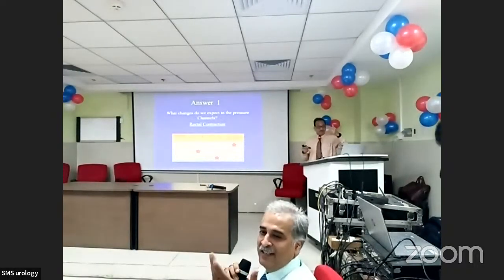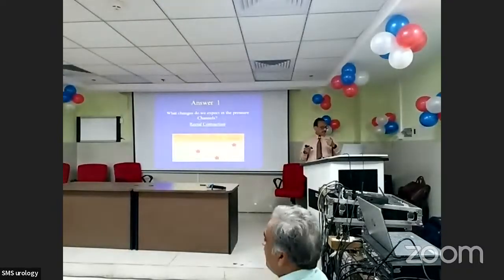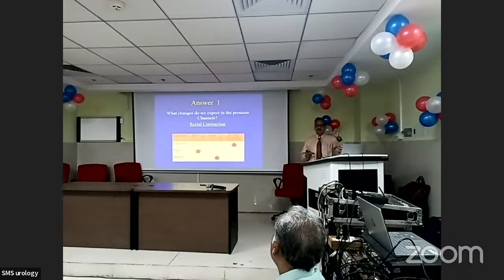We have to understand. So, do you agree with me? The intravesical pressure will not rise, and the rectal pressure will rise because there is a contraction. Now, remember, the computer does prompt electronic subtraction of the pressures. So what will the detrusor pressure do? Fall. Why? Because rectal pressure has risen and the computer has subtracted rectal pressure from intravesical pressure.